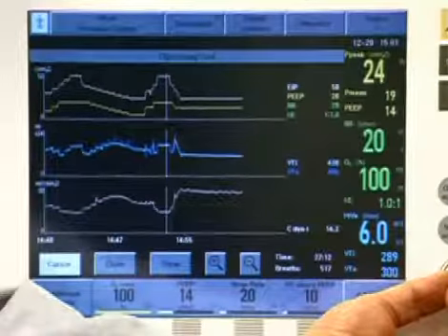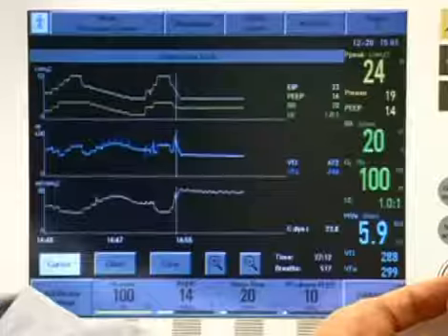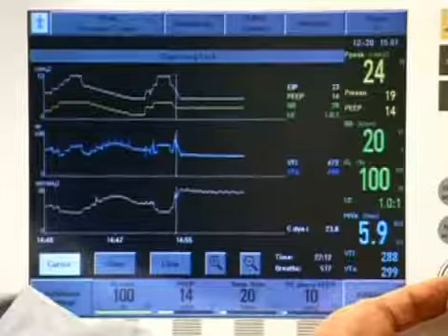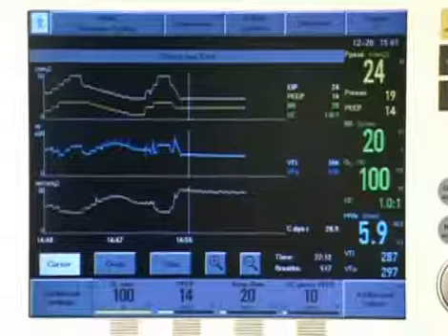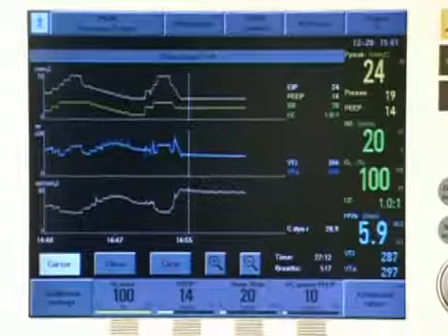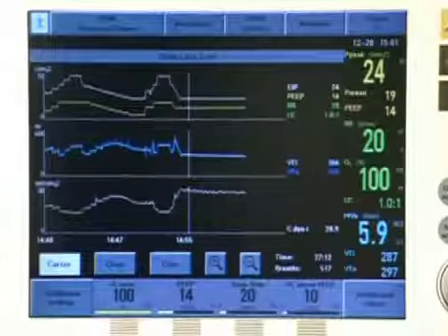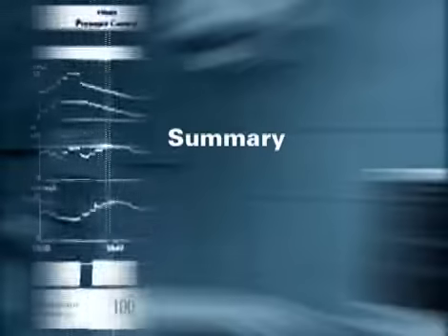New recruitment with the same inspiratory pressures. Reduction of pressures to steady-state ventilation with a PEEP level of 2 centimeters of water above the value resulting in maximal compliance. Final settings, plateau pressure of 24 centimeters of water, tidal volume of 10 mL per kilogram, PEEP level of 14 centimeters of water, and dynamic compliance of 28 milliliters per centimeter of water. The use of online dynamic compliance has helped us to demonstrate the efficacy of the recruitment maneuver, and more importantly, to detect the PEEP level that prevents major ongoing collapse after recruitment.